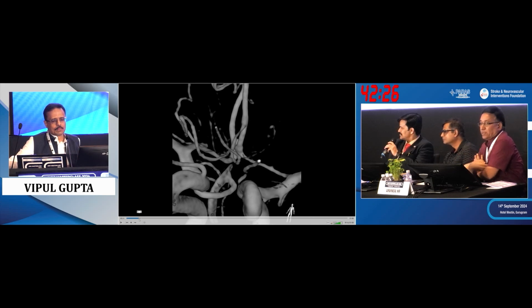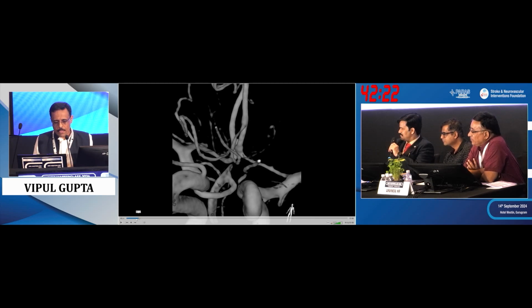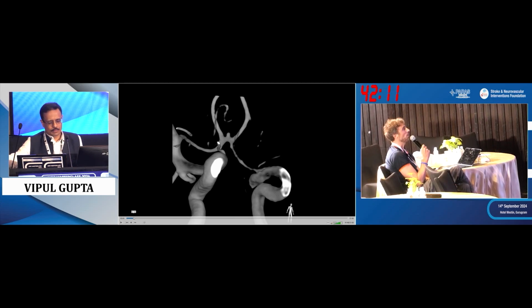Here, in addition, the aneurysm is very small, is looking up. And we know the risk factor for peroperative rupture is small aneurysms and balloon-assisted. So I think the risk of a balloon-assisted attempt would have been quite high. The flow diverter has 8% complication in A1, A2, and here, to my mind, it's not a good option because the aneurysm is not on A1, A2, it's on the ACOM completely. So it's not sure that it has solved the problem.